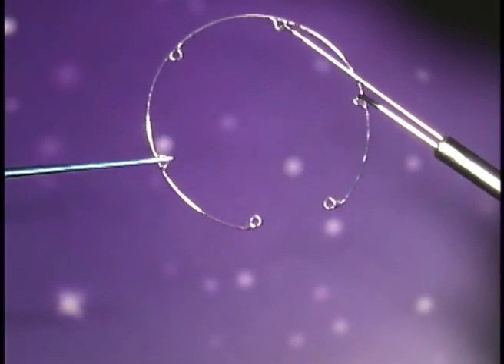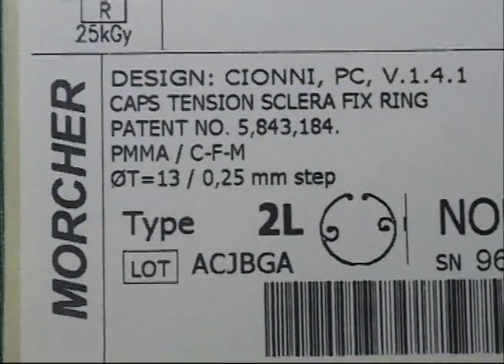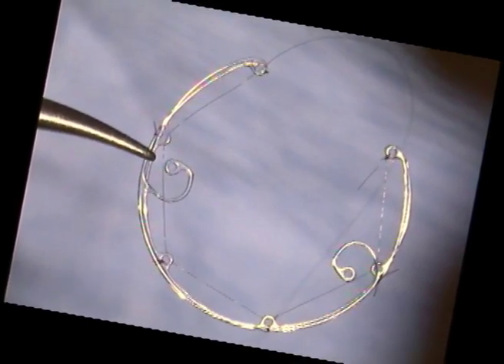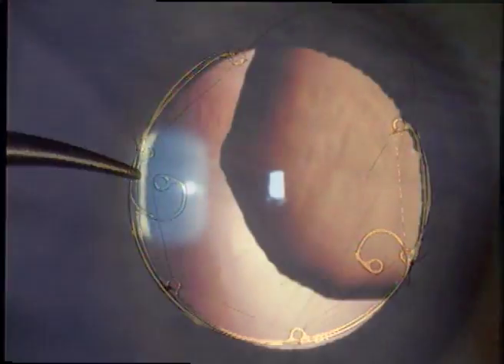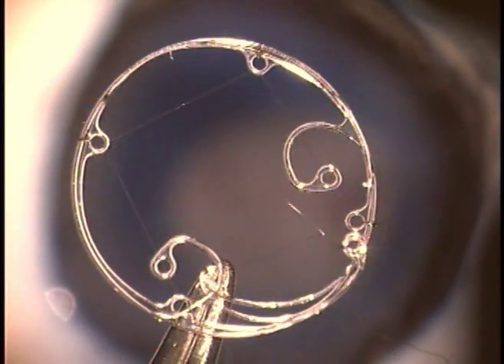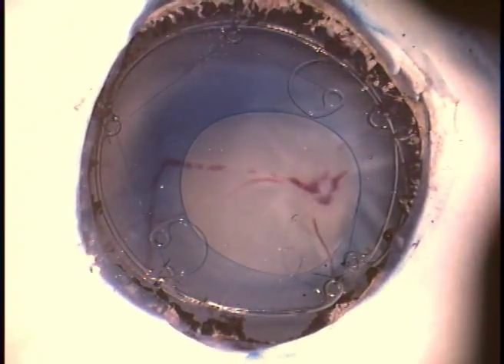This novel method for capsular tension ring insertion could be valuable for use with modified tension rings. For example, the Cionni modified endocapsular tension ring can have one or two intermediate extensions for capsular fixation to the scleral wall. This ring is used in situations of extreme zonular weakness and thus requires a very delicate implantation. The addition of intermediate eyelets could help to reduce the Cionni ring diameter during insertion, expediting the procedure and enhancing safety.